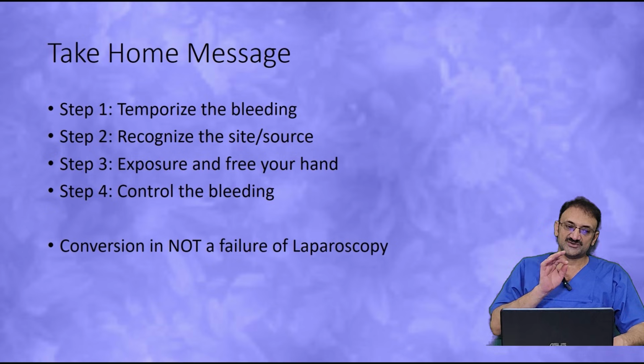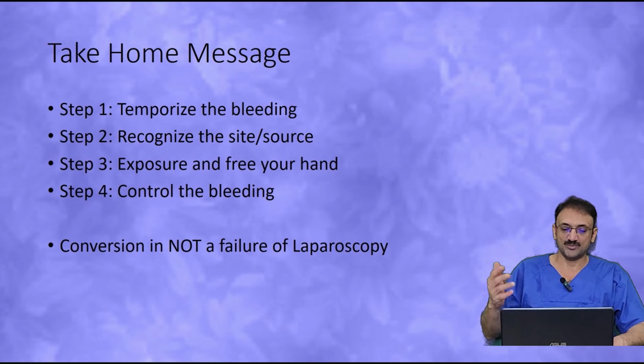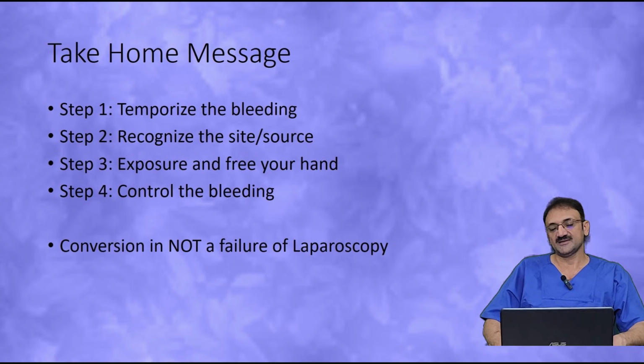And always try to recognize the site. At times there is a small renal vein, a small tributary vein, which is bleeding, and we panic and then we open it or convert it. So always recognize the site and then decide. The exposure must be proper by doing suction and cleaning the area, and always keep one hand free, and always control the bleed before conversion.